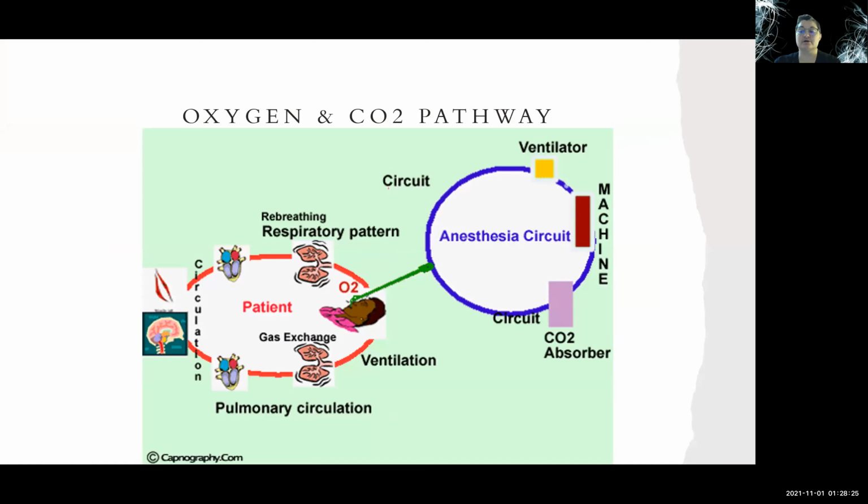Now, under anesthesia, we can trace the flow of gases. Here we have a picture that shows how it flows through an active cycle. Yes, we have a human in this image, however, the same holds for our veterinary patients. The machine is going to push the gases out to the patient, whether that's through a ventilator or just through a normal breathing circuit.